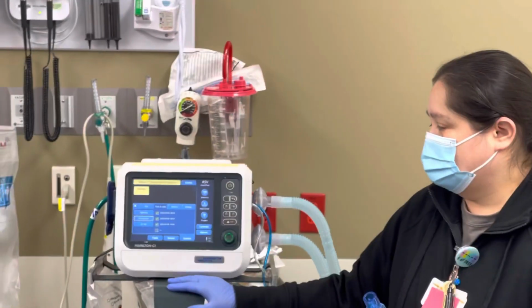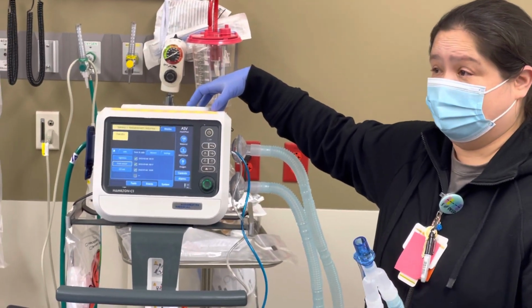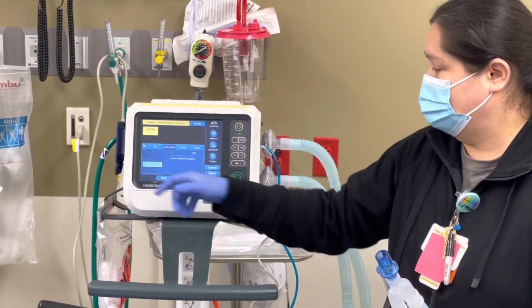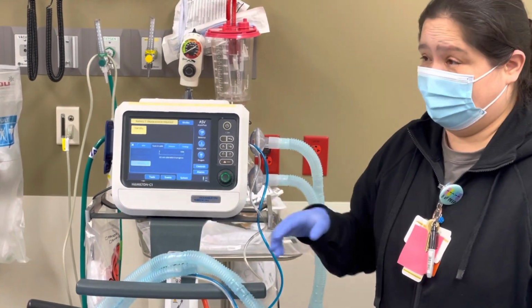So the last thing we always check is our O2 cell. We just wanna make sure that the O2 cell inside the vent is working properly. And so this one takes a little bit of time. Okay, does anyone have any questions over any of that?